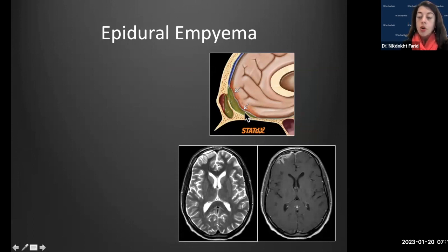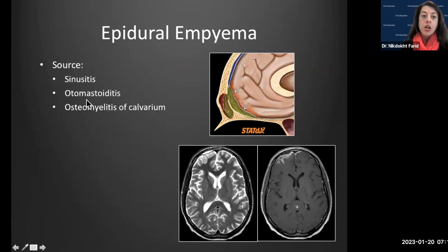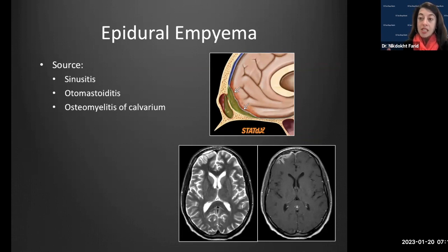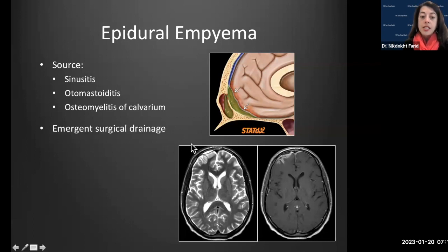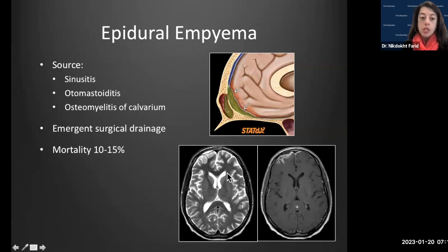Epidural empyemas are usually coming from an adjacent source — the sinuses, mastoids, or calvarium due to osteomyelitis. They usually need surgical drainage, and even small ones need close monitoring because of a relatively high mortality rate.